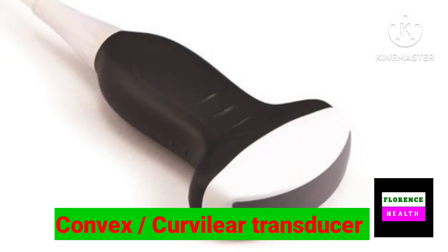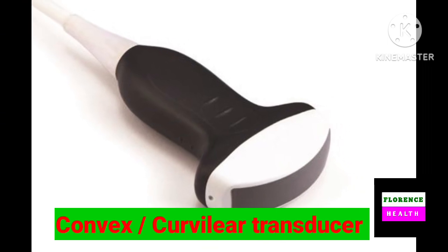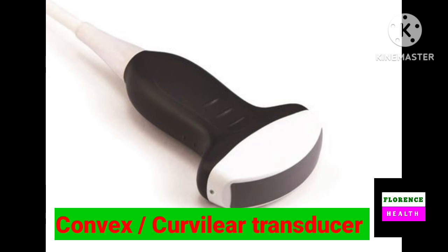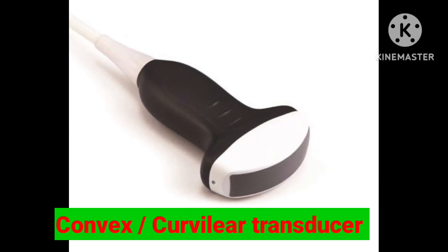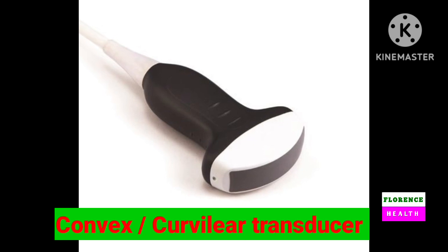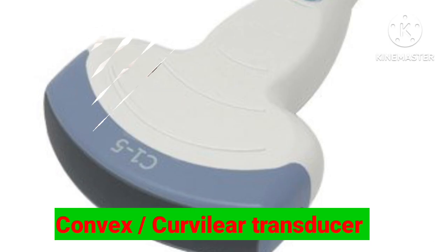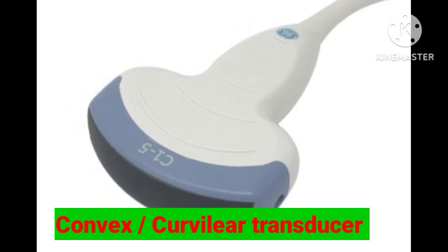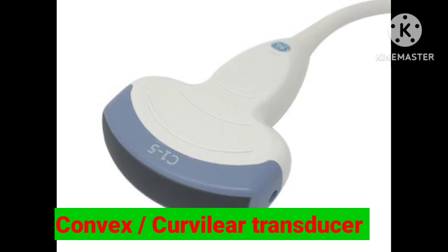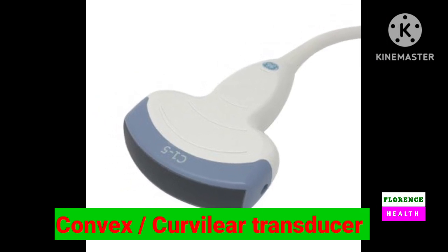This slide showing a convex or curvilinear transducer. As the name suggests, one end of the probe is convex or curvilinear. It is more commonly used for abdominal examination or fetal ultrasound. It uses lower frequency. Due to having lower frequency, it has more penetration. It uses the frequency between 2 to 5 MHz.